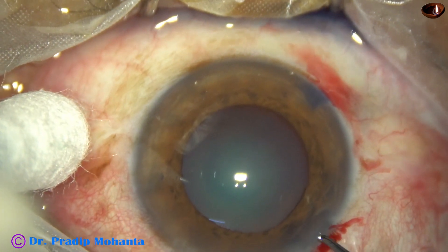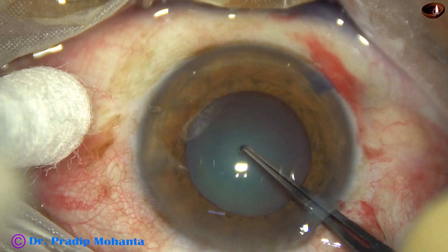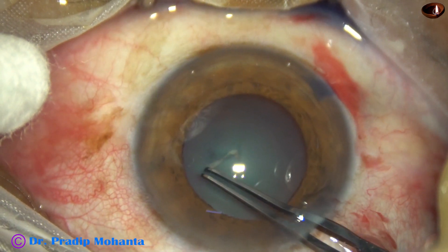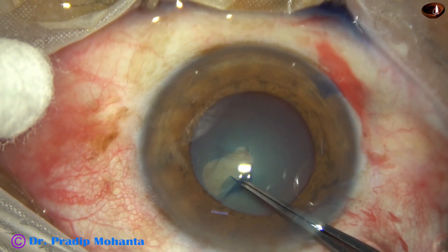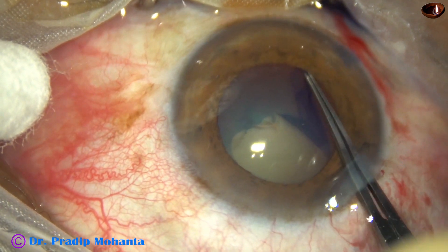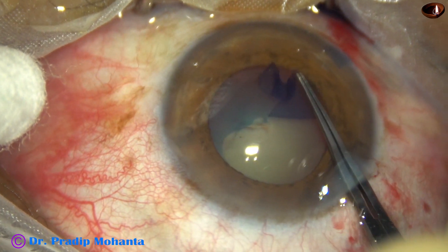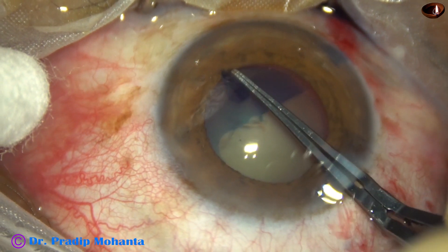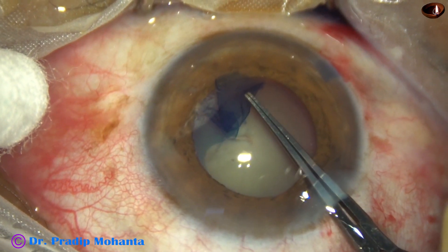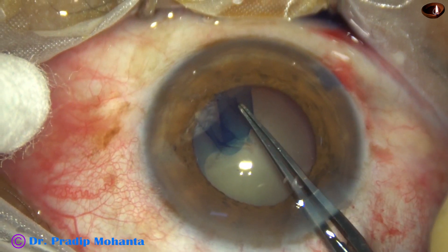Now let us see at 50% of normal speed. Goes in, pierces, rips apart the anterior capsule. One prong goes into the cleft, another one onto the capsule, holds the capsular tag and re-grasps, releases going about 3 o'clock. Now let us re-grasp and complete the rhexis.